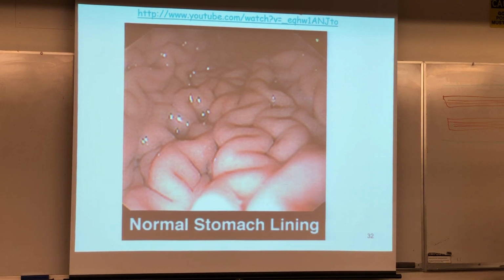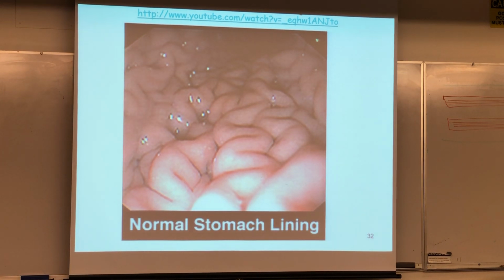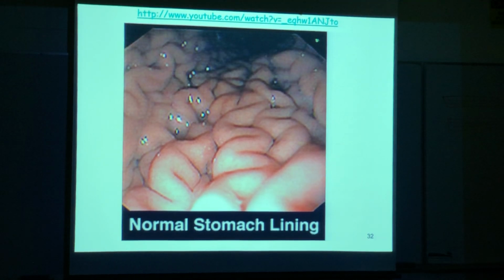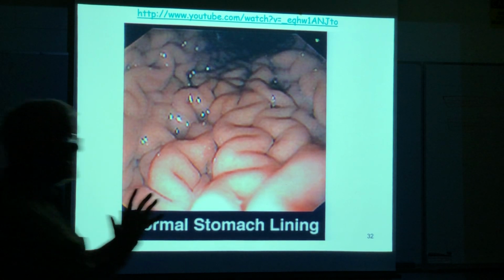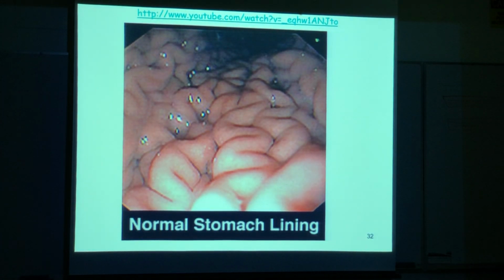And we have a fun little video to watch. We're going to be watching a gastric camera going all the way into your jejunum and being pulled backwards out. It's going to go from your small intestine into the pyloric region, into the body, up the fundus, up the esophagus, past your vocal folds, and out. And you're going to be able to see what the inside of your stomach looks like and how they go about looking for the possibility of H. pylori.